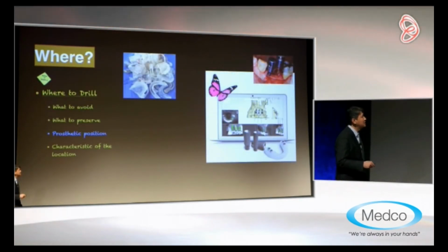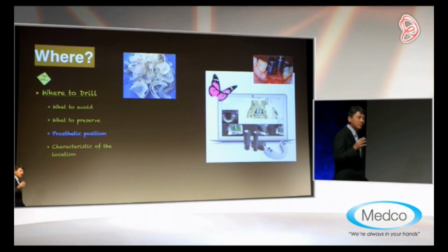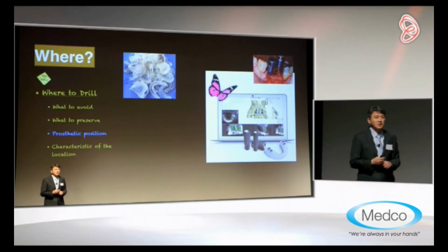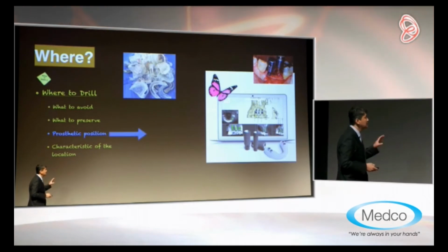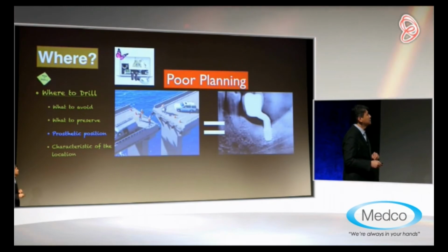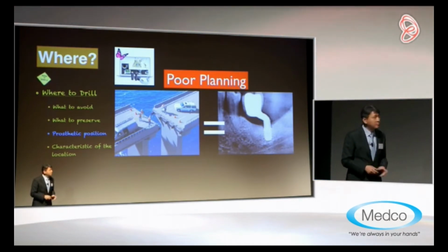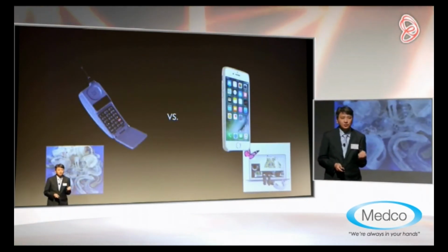So please utilize the iPhone 7 of implants, which is digital planning and guided surgery. Don't use the old technique. As Dr. Brower mentioned, this doesn't give us the angulation, it merely gives us location. And it's not as accurate as guided surgery. So with proper planning, we can avoid blaming each other for poor outcomes. With proper planning, we're able to deliver the best dentistry to our patients.